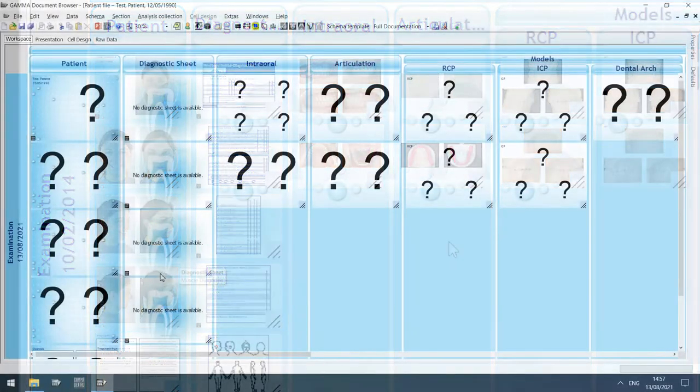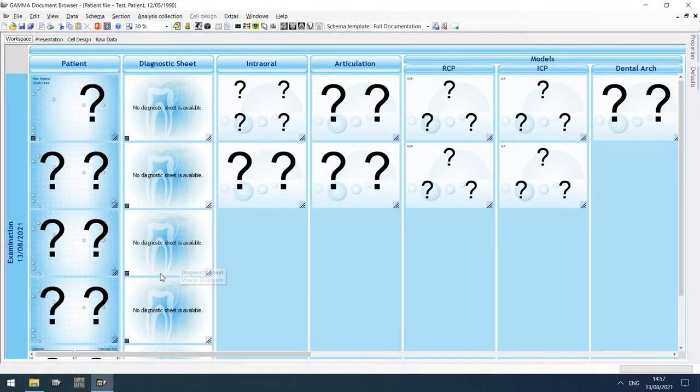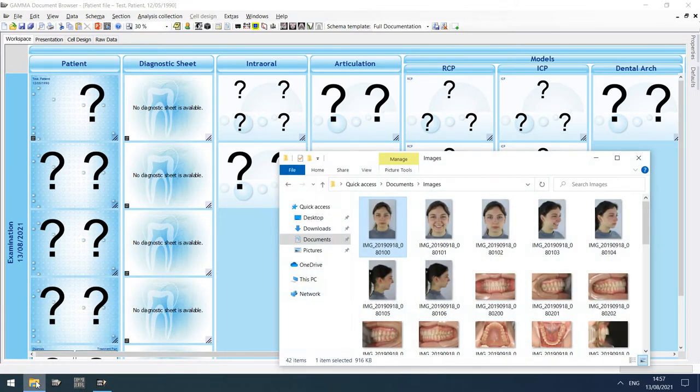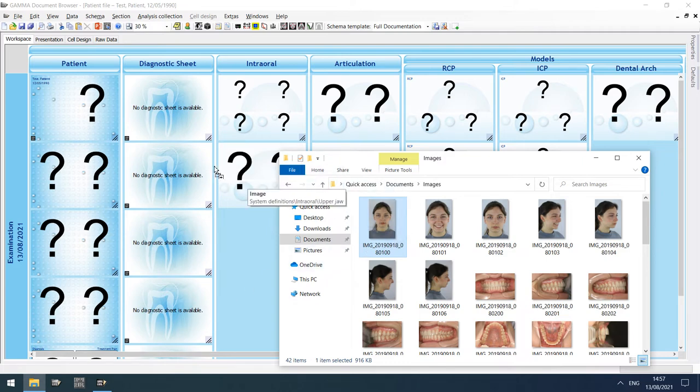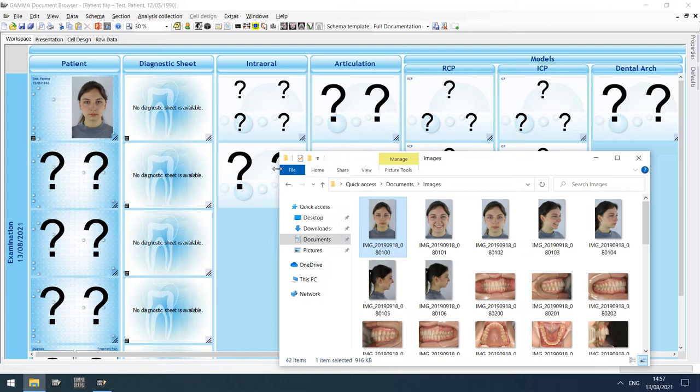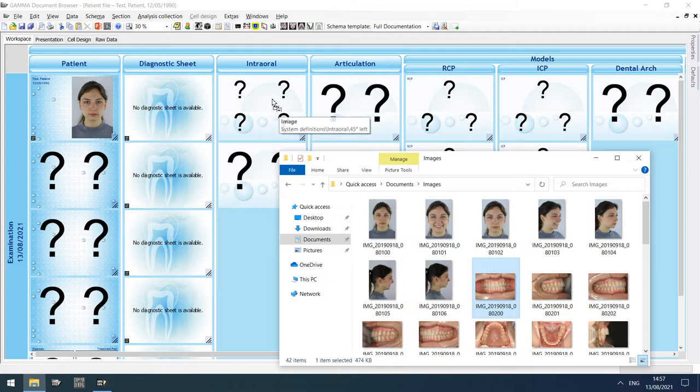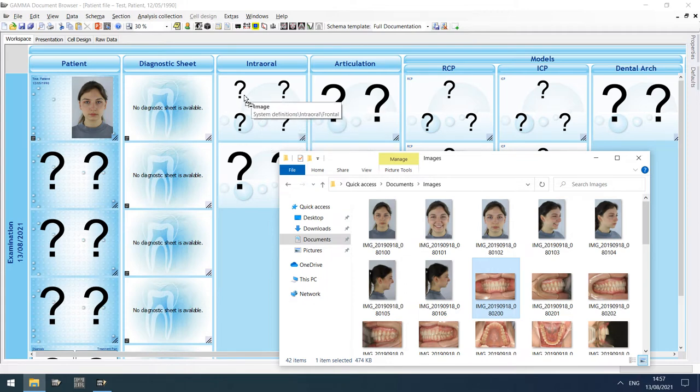The easiest way of importing images is via drag and drop from your file explorer. Simply open the folder that contains your image files, select the image you want to import, and drag it onto the appropriate data area. Note that each data area expects a specific type of image, which will be displayed as you move your mouse over them.